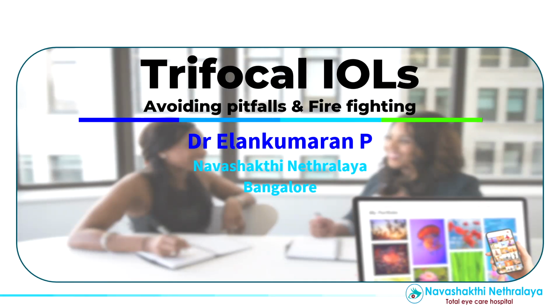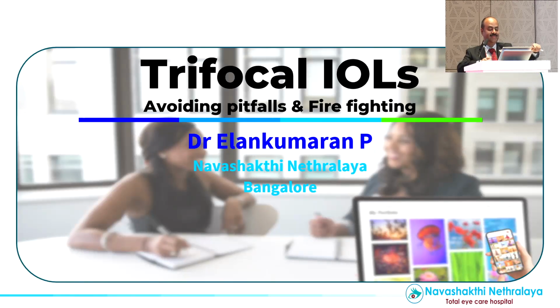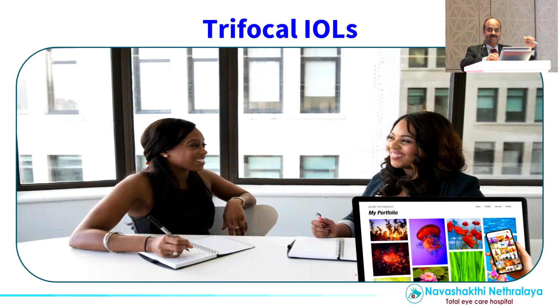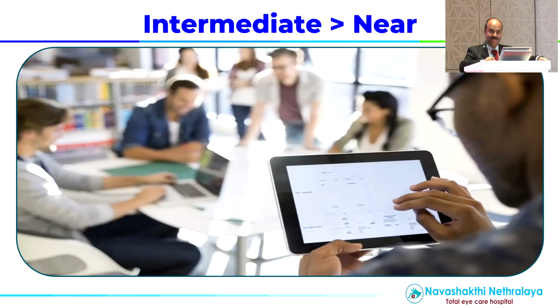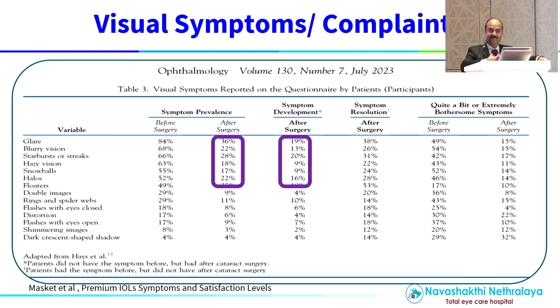Thank you, Dr. Umesh. My topic today is avoiding pitfalls and firefighting in IOLs. All of us would prefer to have our patient with clear distance and near vision. This is what our goal was 15 years back. But intermediate vision of late has become very, very important thanks to all these gadgets that we are using nowadays. Most of our reading is on gadgets, so intermediate vision is very important.